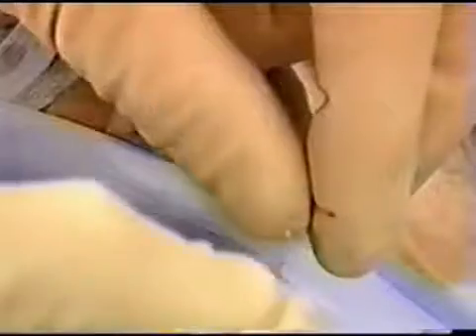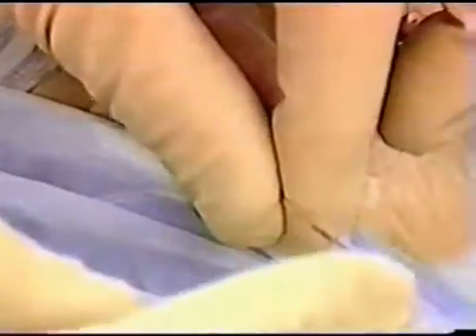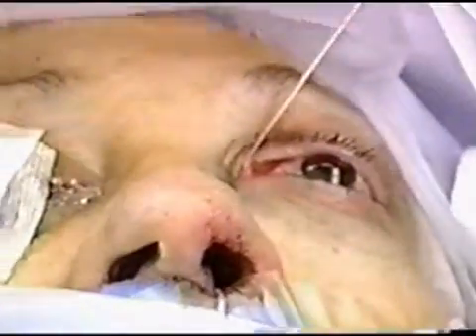The small diameter end of the stent with the enclosed short probe is then inserted into the sheath. The sheath is then pulled back out the superior canaliculus, thereby pulling the probe and small diameter end of the stent out the superior canaliculus.